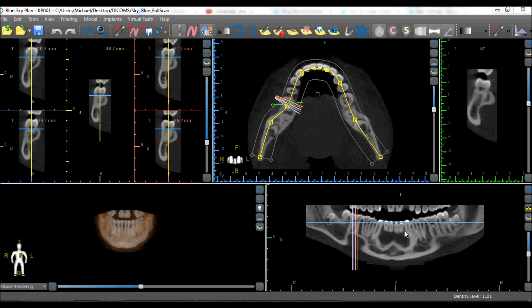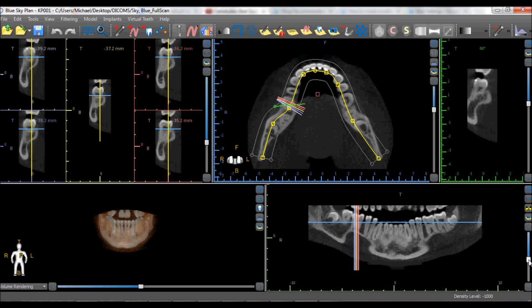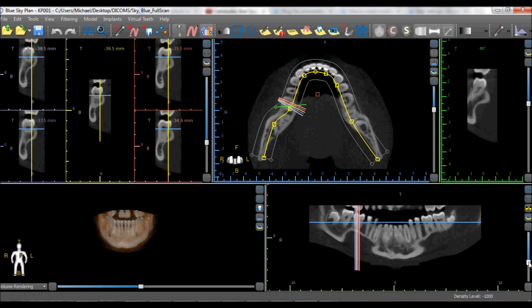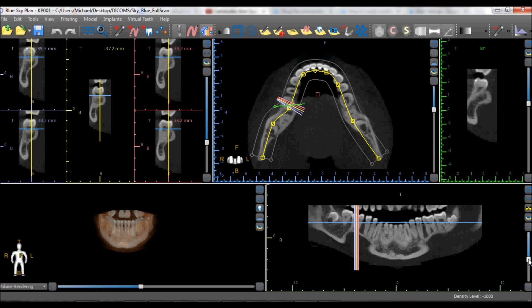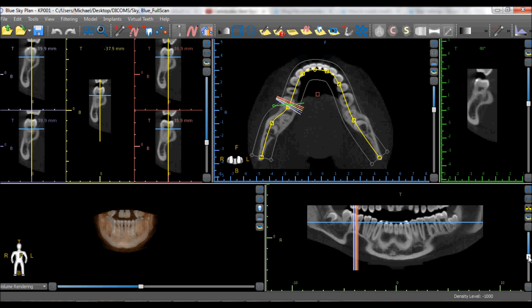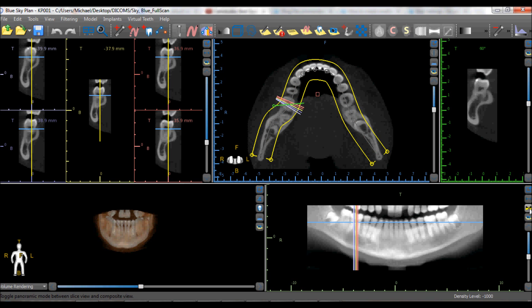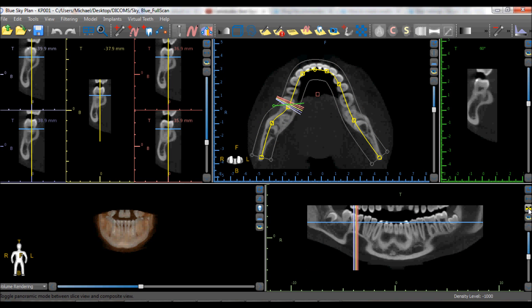The field of view affects the range of slices visible in the panoramic view as the middle panoramic curve moves between the inner and the outer panoramic curve. It also affects the range of slices visible in the composite panoramic view when the third icon to the right of the panoramic view is clicked. This concludes the panoramic curve functionality training tutorial.